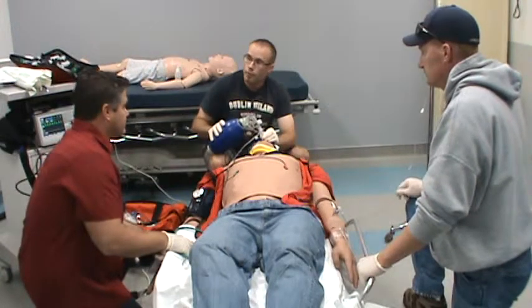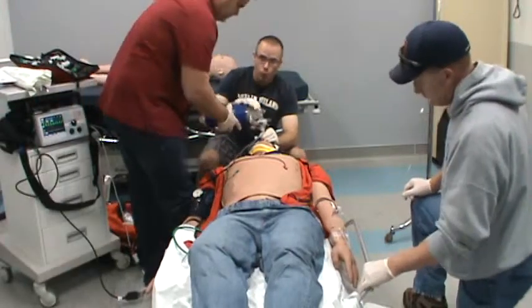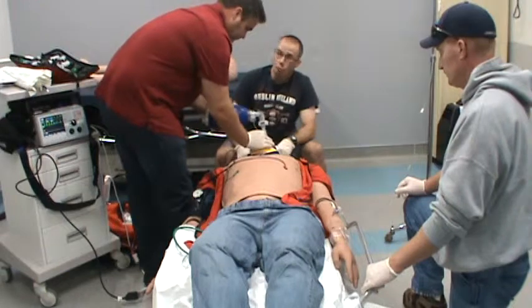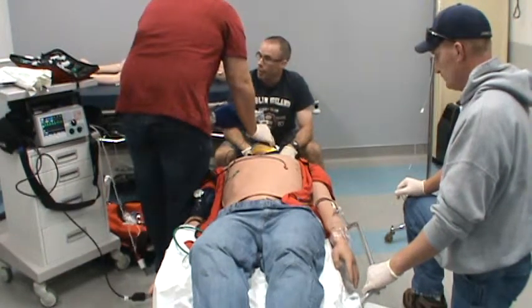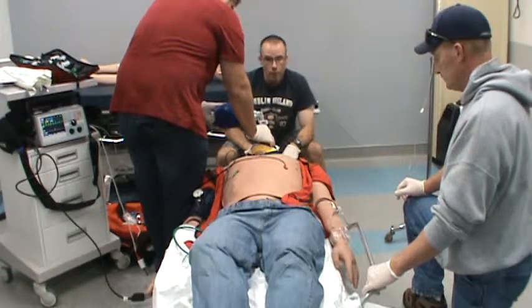I'm going to have you go ahead and take over ventilations. If you notice any change with that, if it begins to become more difficult, or if we don't have waveform, let me know immediately. We might have to pull the tube and go with a Combitube. I'm going to go ahead and call the hospital at this time, let them know we're coming in.